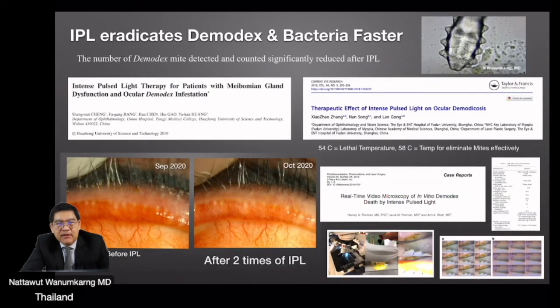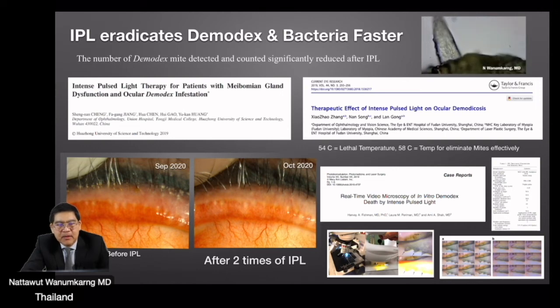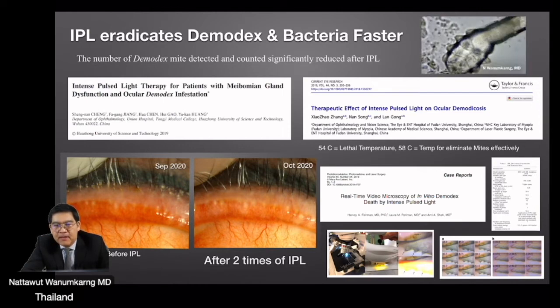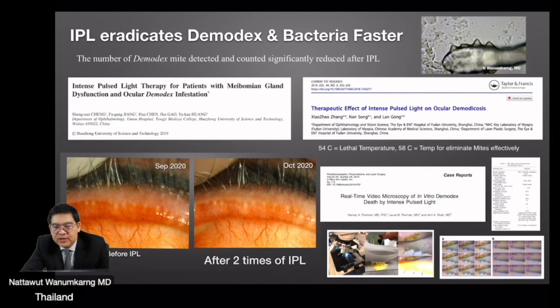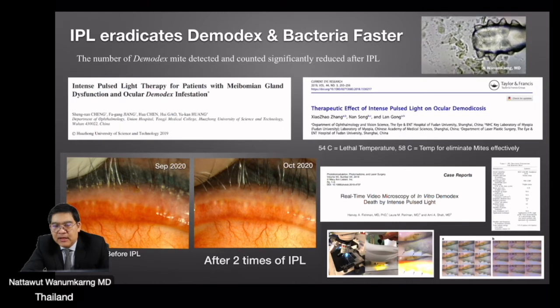Many studies confirm that the IPL helps to eradicate the Demodex and the bacteria faster. The picture shows that after only 2 IPL treatments, the Demodex could be eradicated completely. One of the studies by Dr. Chang showed that IPL raising the temperature to about 54 or 58 degrees Celsius can completely eliminate the mite effectively.